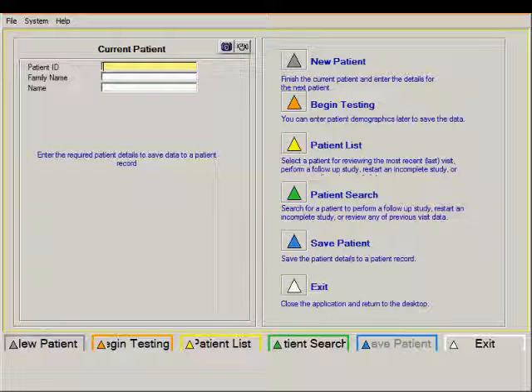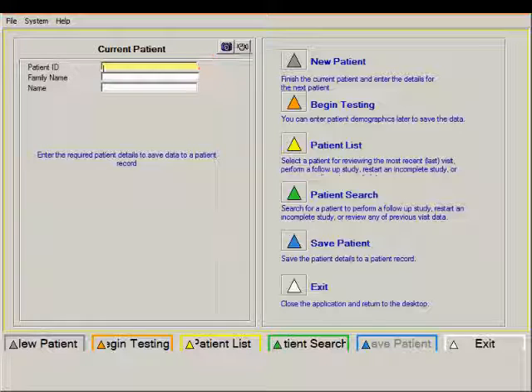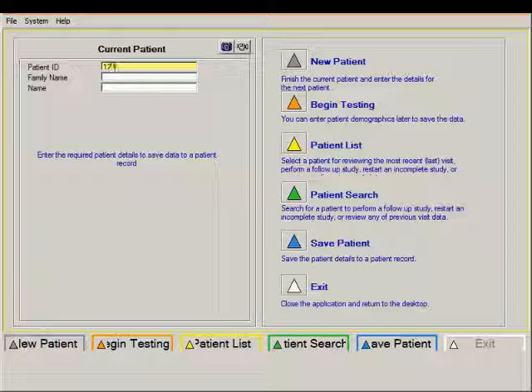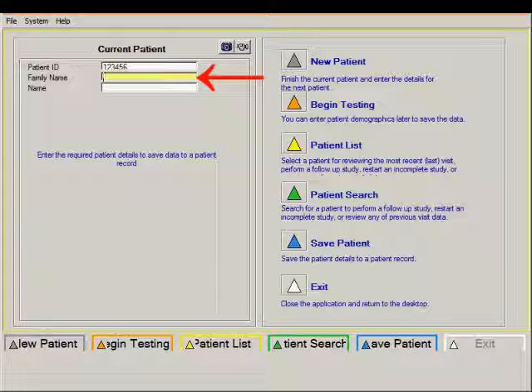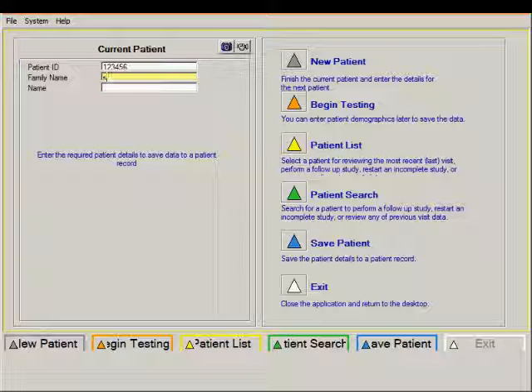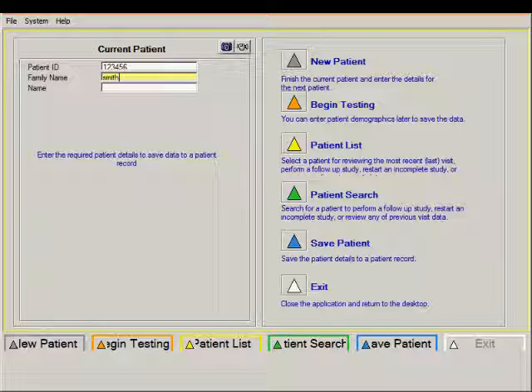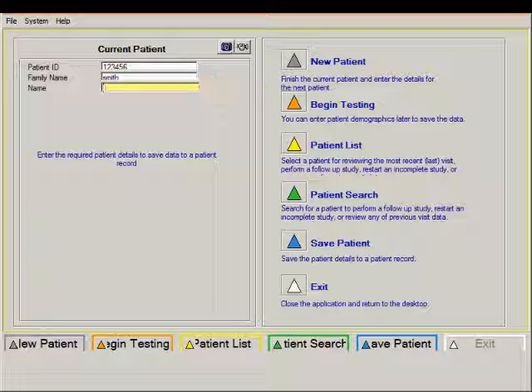Once you do that, the highlight for the patient ID number appears in yellow on the left half of the screen. At this point you just need to enter in the patient's ID number and then press enter and the highlight will then move to the next cell for the patient's last name. Type in the last name, press enter, and then enter in the first name.